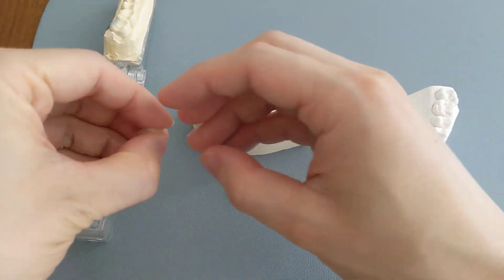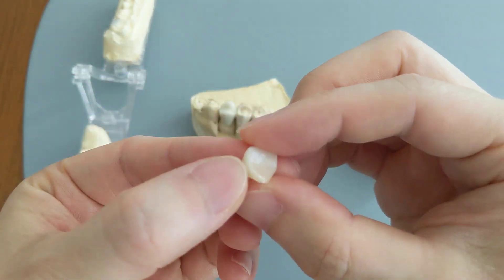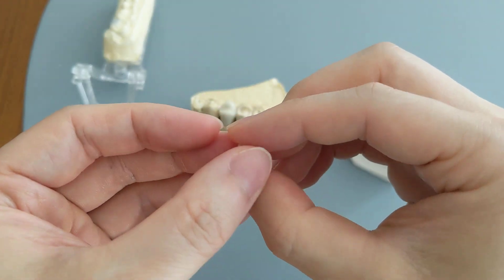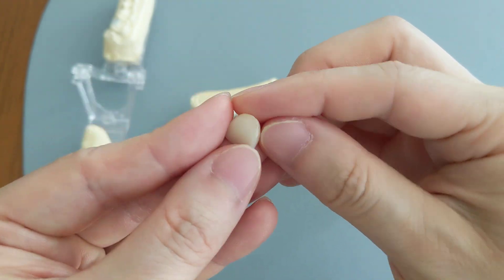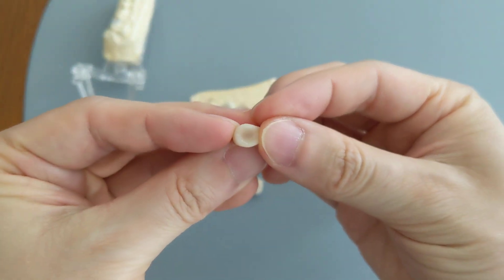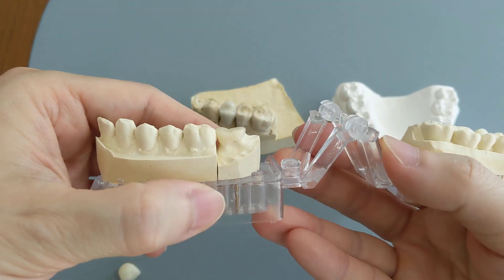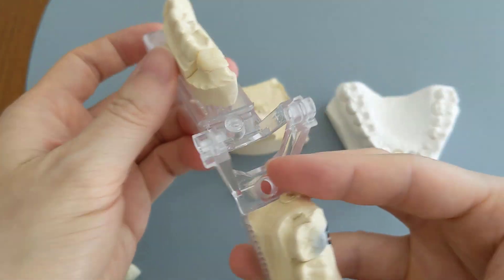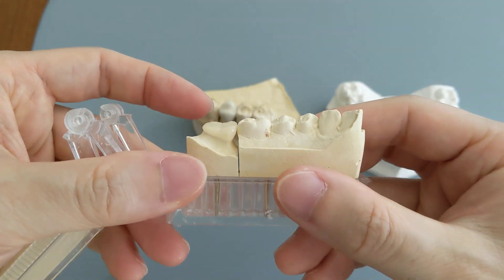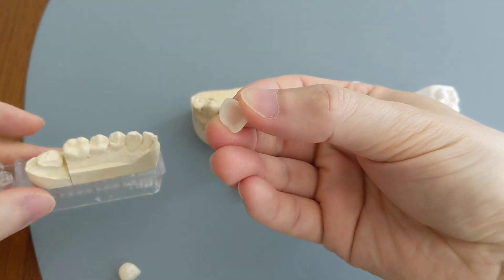Let's start with the all porcelain ones. This is an all porcelain front tooth. Rotate it around so you can kind of see. As you can see, this tooth cap looks like a front tooth and there is no metal on the inside. We also have a back tooth all porcelain one — once again, there is no metal underneath of it.